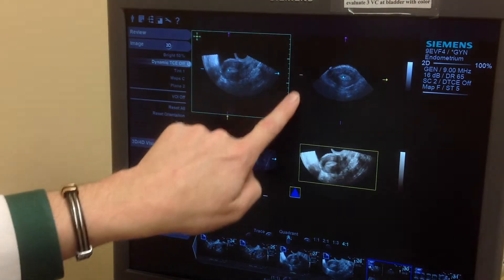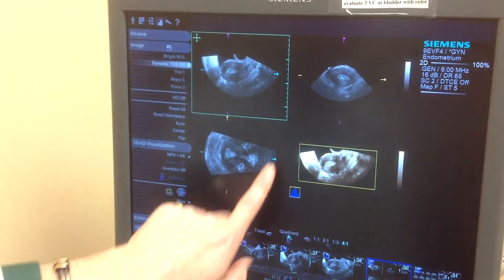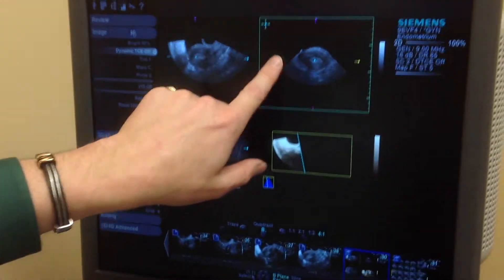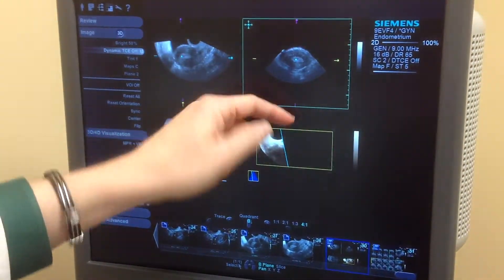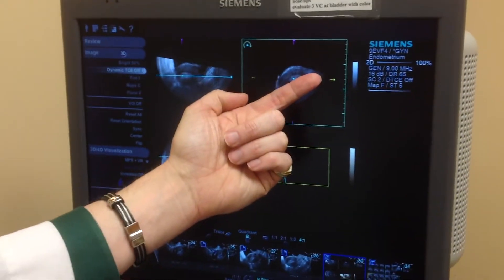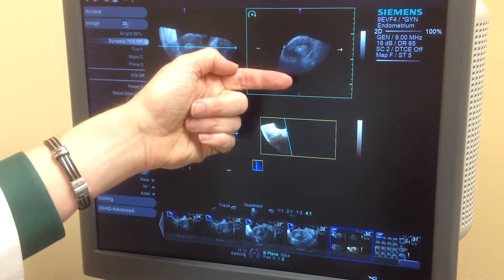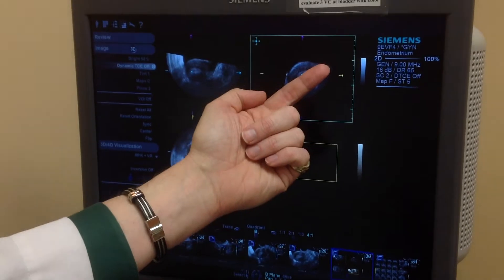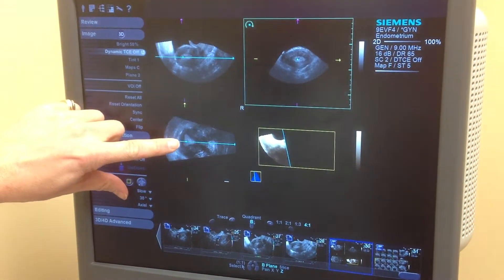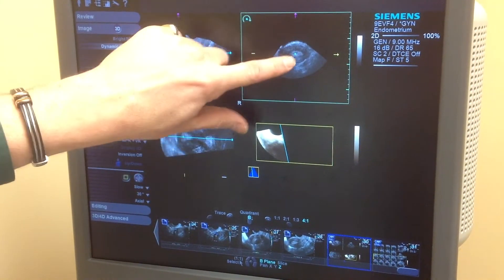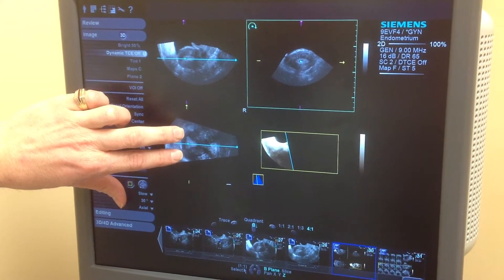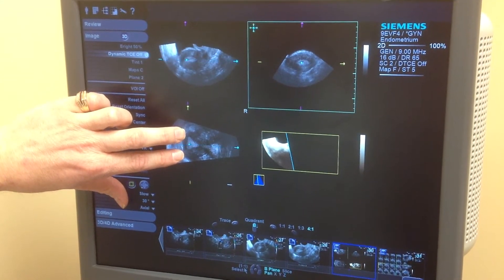Then I'm going to rotate using my quadrant button and go to the B quadrant. I can Z this one with my Z control as well. Many times the patient's uterus is a little off-axis one way or the other. If the patient is off-axis, you're going to line it up with that coronal plane straight across — and as you look down, you can see as I start lining it up, the coronal will start coming in and out of plane, and you can finely adjust accordingly.